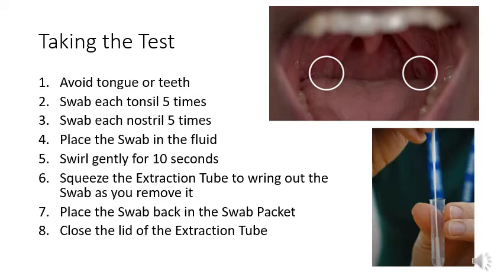Then place the swab into the fluid in the extraction tube. You need to gently swirl it for about 10 seconds, aiming to get as much of the mucus off the swab and into the fluid.